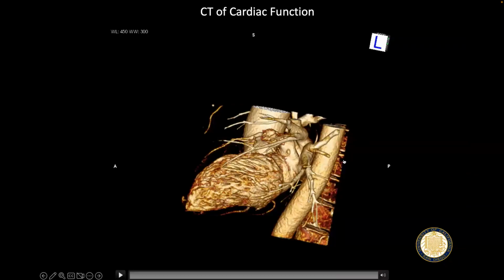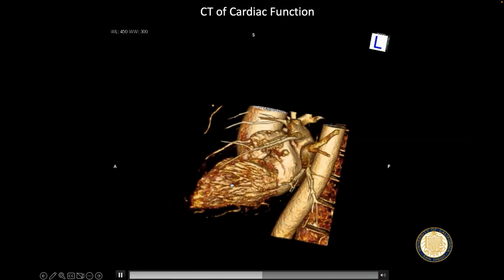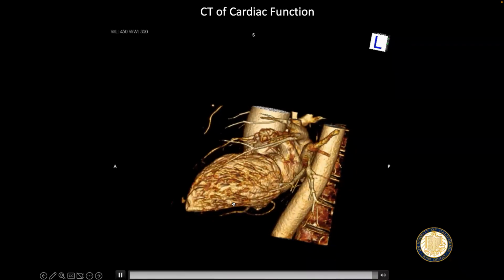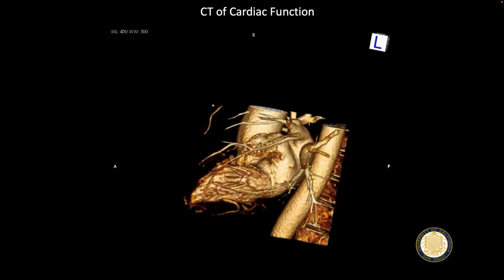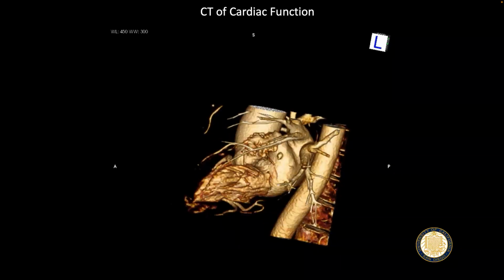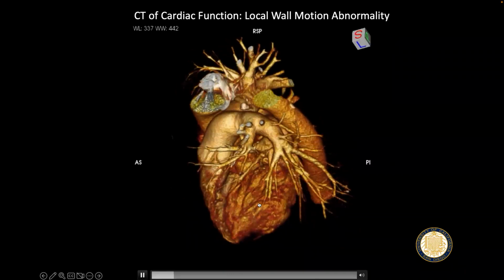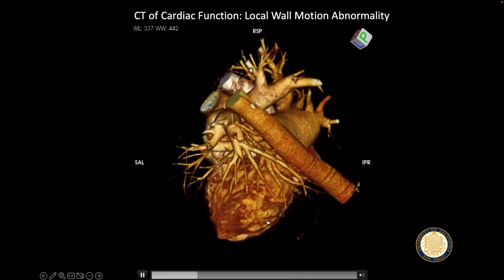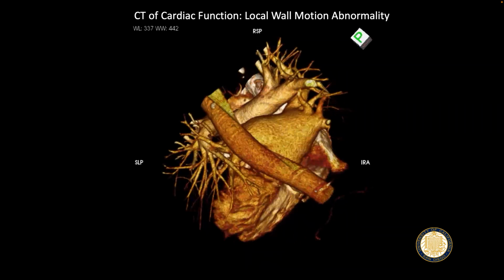Whereas on CT, you look at this and you go, oh man, you can see them directly, right? And so you can measure how these little individual nooks and crannies are actually moving over time to calculate or to detect abnormal motion. And so here's an example of that patient, right? See this golf ball right here? It's just not moving. Those nooks and crannies are not getting any closer together. They are just getting dragged around.